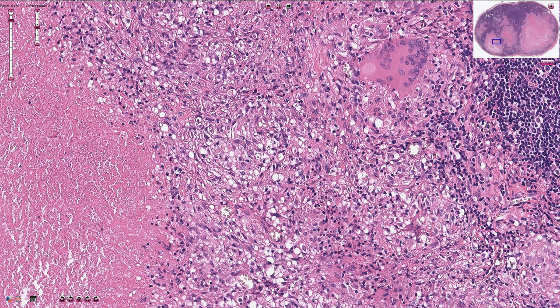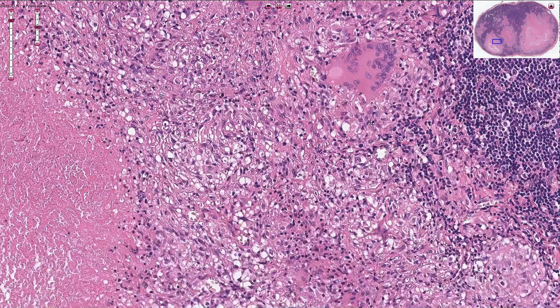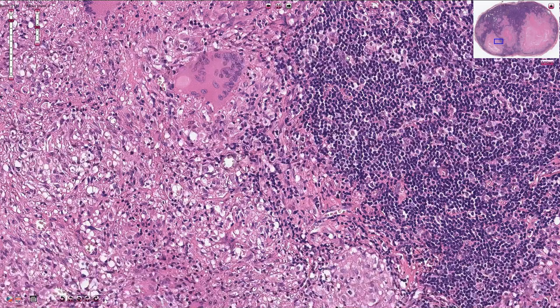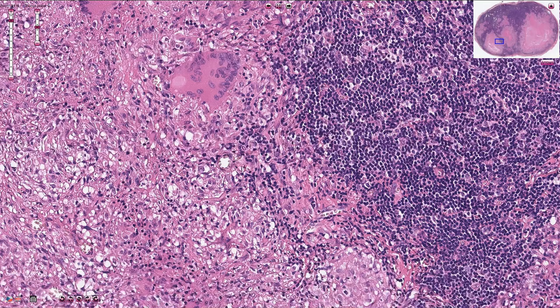Interferon gamma is also responsible for the transformation of macrophages into epithelioid cells, which is what we see here, and the Th1 cells along with other T cells are also seen here.